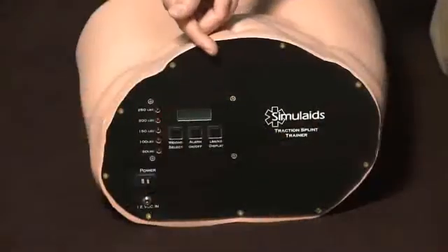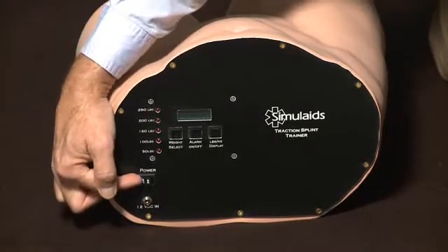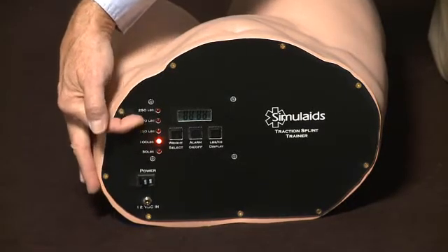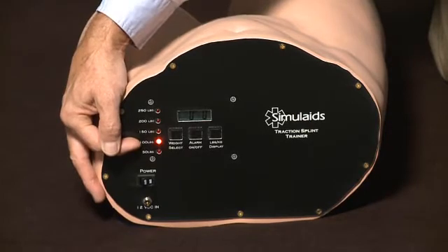To start this product, which is totally battery operated, hit the on button. It will show up at the pound setting of the last operation, in this case 100 pounds.